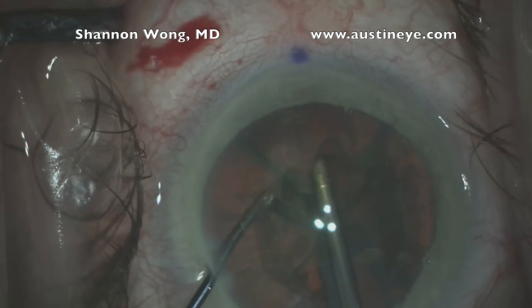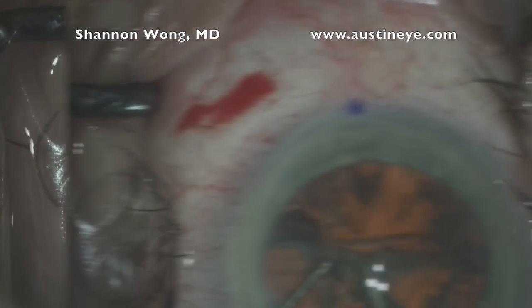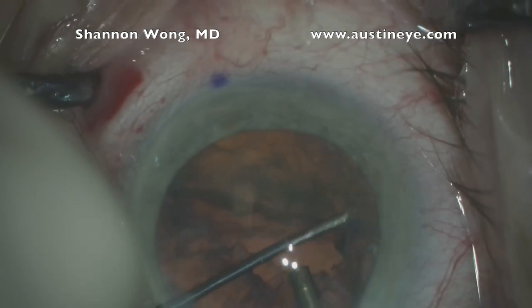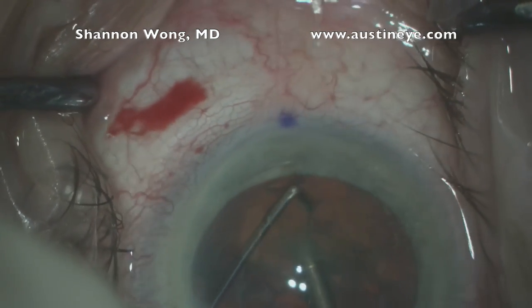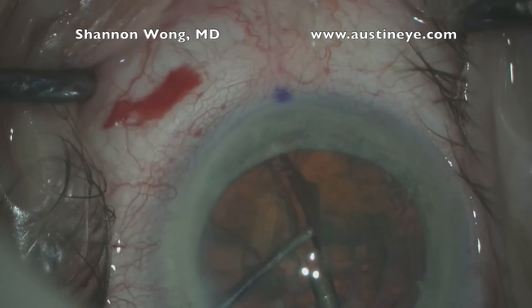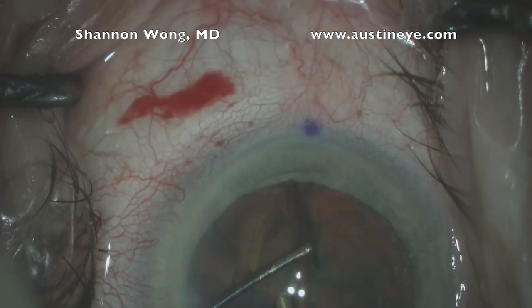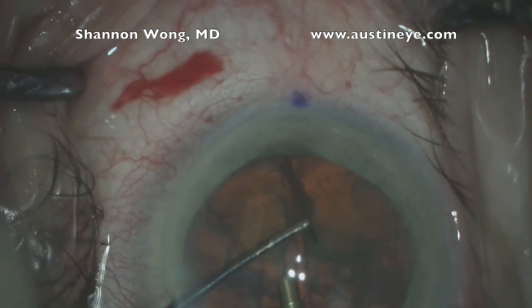I take the first two quadrants and now have one hemisphere or one half of the nucleus remaining. The anterior capsule is intact, and now at this moment the anterior capsule splits. This chopper is not sharp, but the stress of splitting the nucleus puts strain on the anterior capsulotomy.